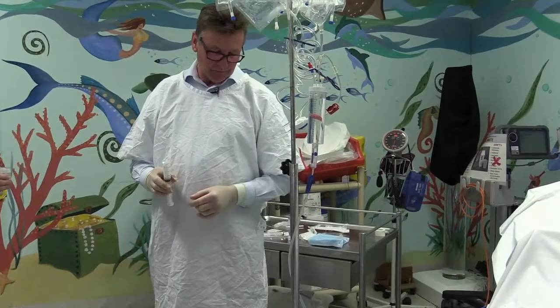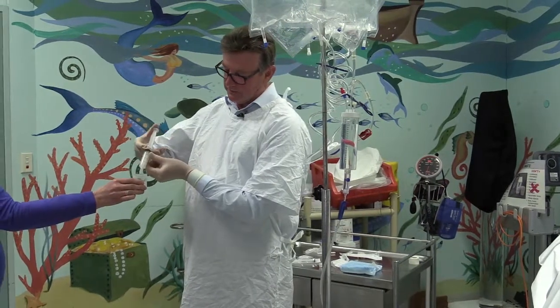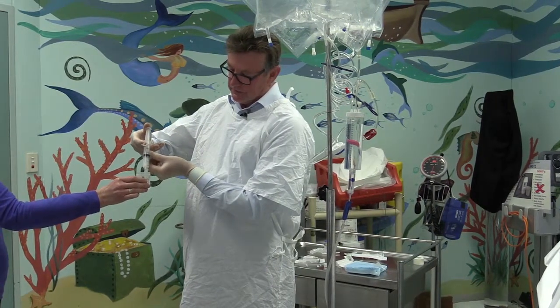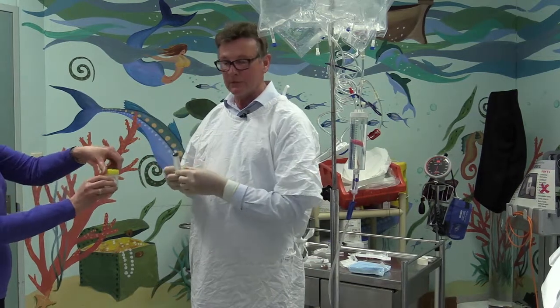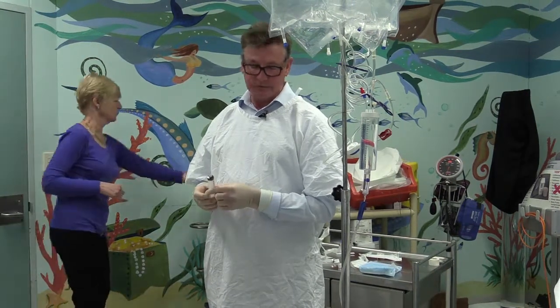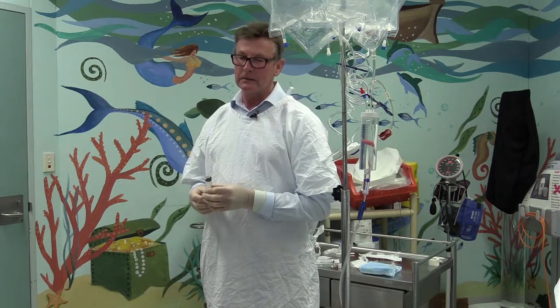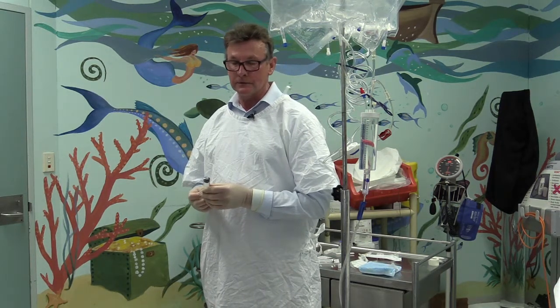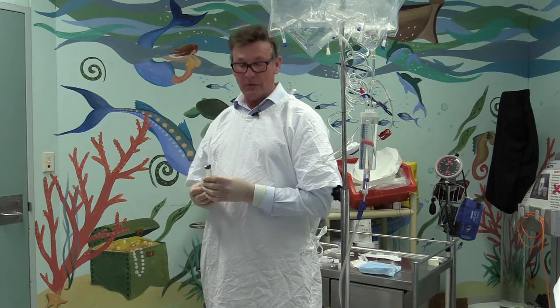Once you've sampled the effluent, it gets placed into a sterile container using a no-touch technique, and that's then sent to the laboratory, if possible, for a gram stain, so that they can identify the organism. If not, sent for a white cell count, and any white cell count of greater than 100 is indicative of infection.